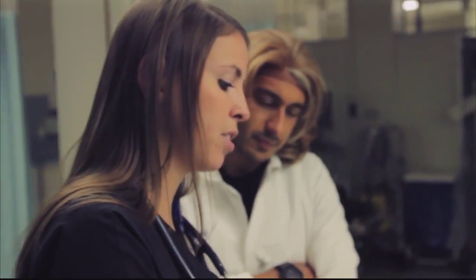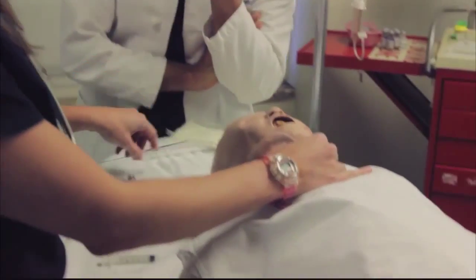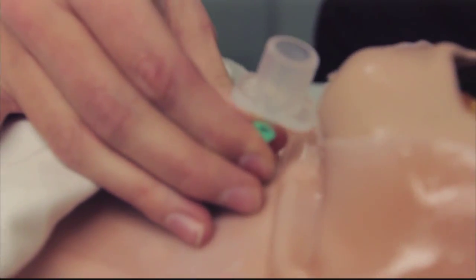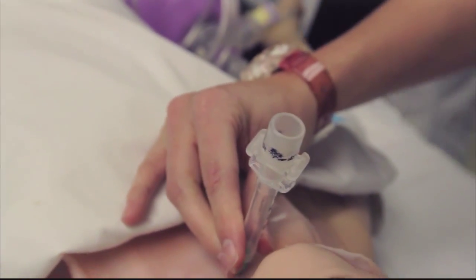Transtracheal jet ventilation, good idea. Let's go through that. First, I would take a 14-gauge angiocath. I penetrate the cricothyroid membrane at a 45-degree angle. Once I am sure that I'm in, I thread the catheter down. And then all you have to do is take an ET tube adapter from a size 3 endotracheal tube, attach it to the angiocath, and then you can bag directly through that. What if you don't have a 3.0 ET tube? I would just take my 3cc syringe, use the Luer lock, attach it to the angiocath, remove the plunger, and then you can use the ET tube adapter from a size 7.5 endotracheal tube, attach it there, and then you can bag through that as well.